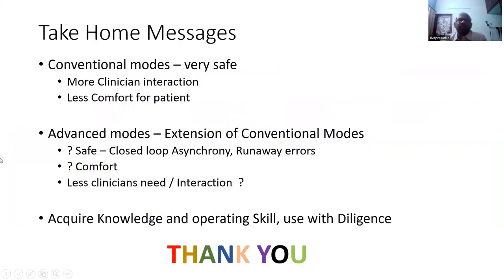The take home message is that conventional modes are very safe, but the only thing is you need more clinician interaction. You have to sit near the ventilator and adjust it as the patient recovers. And sometimes it might be less comfortable for the patient because you don't have any freedom during ventilation. But advanced modes, though they are extensions of conventional modes, are they really safe? We don't know. Sometimes there are specific entities like closed loop asynchrony and runaway errors that can occur because the machine is fully automatic now.